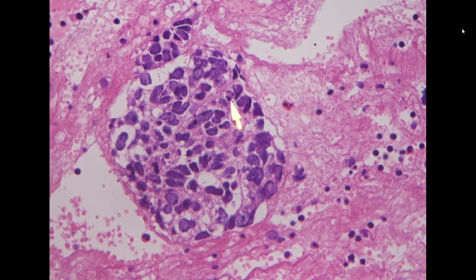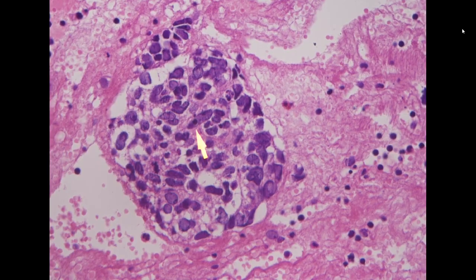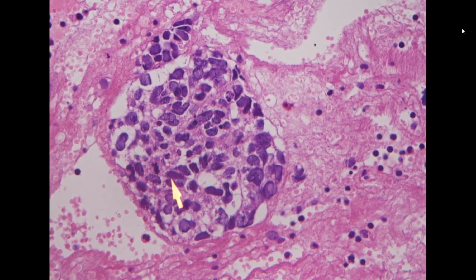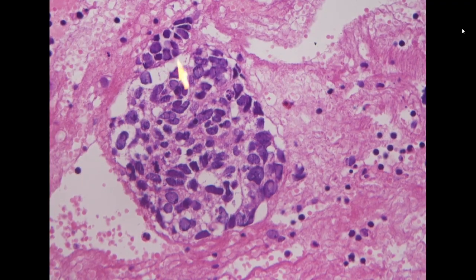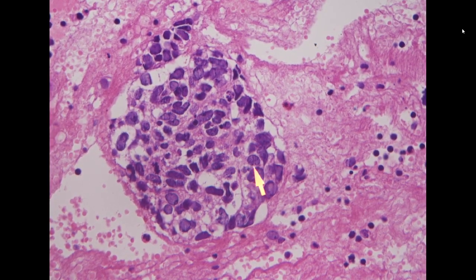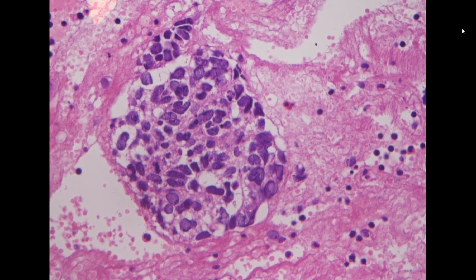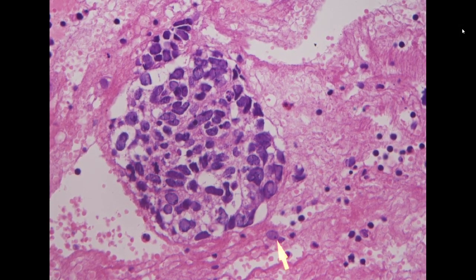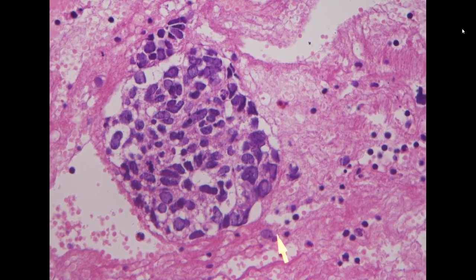you can see, there are a lot of apoptotic bodies within this cluster. Adenocarcinoma usually doesn't have that. It's more the feature of small cell carcinoma. So you see mitosis, you see apoptotic body, and you see molding over here, and the chromatin pattern is compatible with small cell. So basically, this is also a cluster of small cell carcinoma.